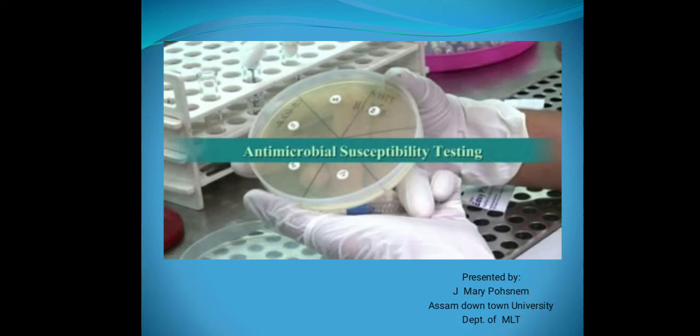The zone of inhibition, however, varies with the diffusibility of the agent, the size of the inoculum, the type of medium, and many other factors. Only by taking all these variables into consideration can a reliable method be worked out. The Kirby-Bauer method is a standardized system that takes all variables into consideration.